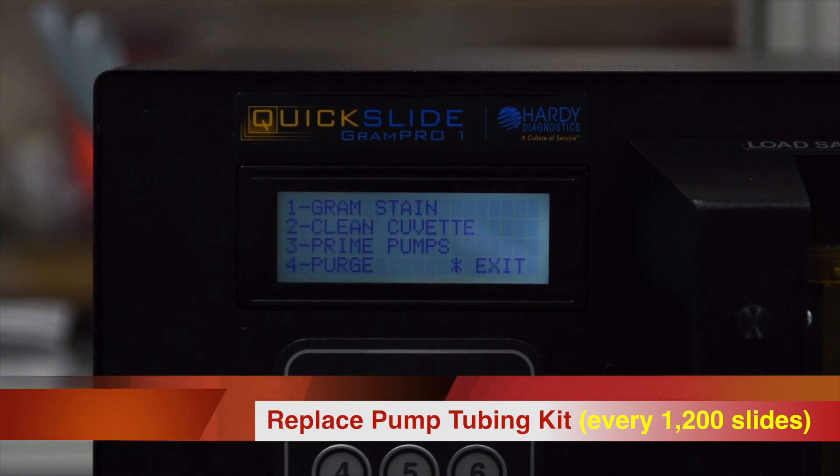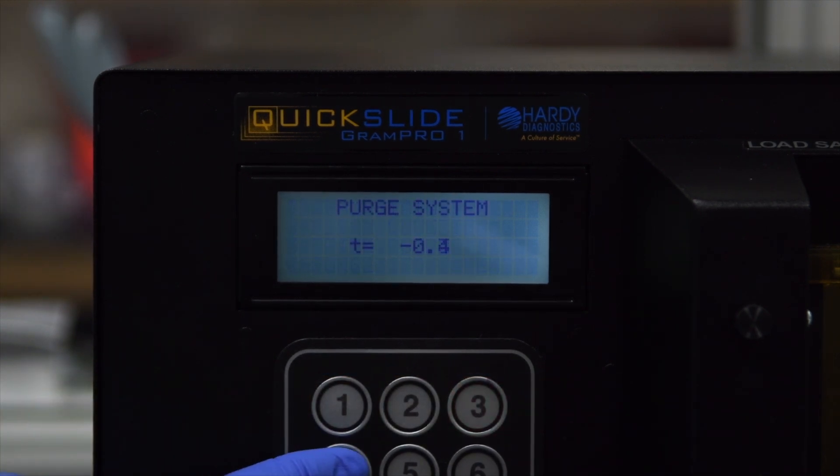Press 1 to select Run. Press 4 to select Purge. Repeat this step twice to make sure that all the reagents are emptied from the tubes.